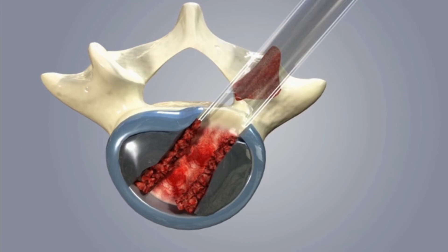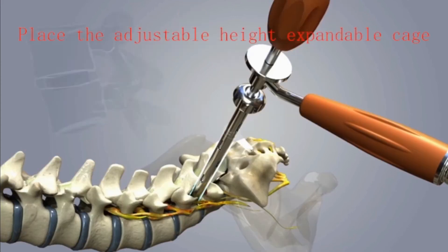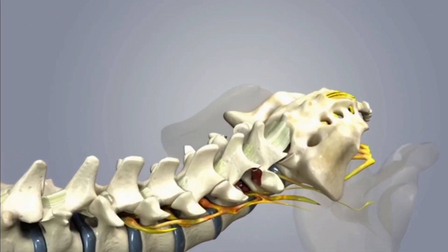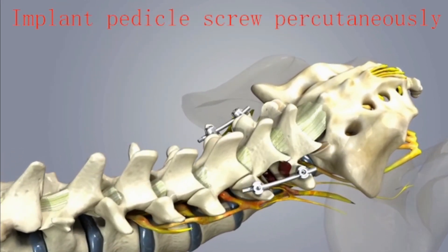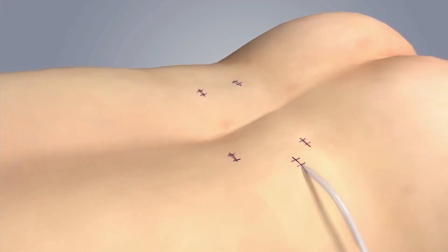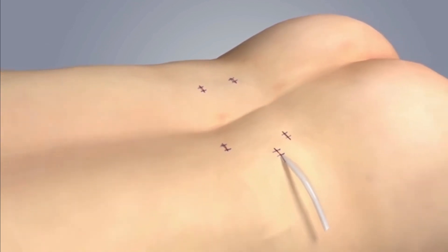The spinal canal was checked with the endoscope, making sure the nerve root was totally relieved. Four pedicle screws and two rods were inserted percutaneously. Sequentially, the screw-rod attachment was tightened, the skin was sutured, and a drainage tube was placed.